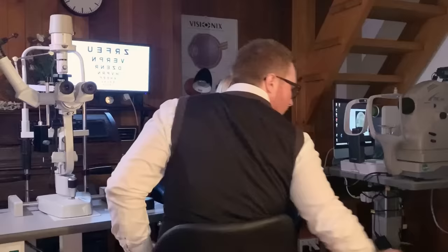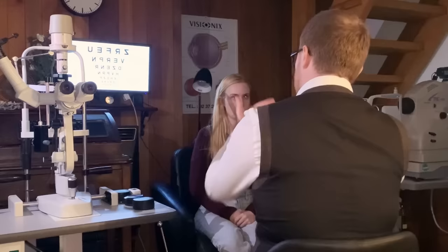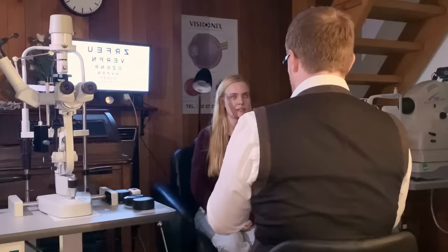Right. So the next thing we're going to do is have a look at your eyes on the microscope. So we've obviously taken some nice images of the back of your eyes, but the microscope will give me a good close-up view of all of the structures of your eye at the front and the back. So it'll be just a good addition for checking your eye health. And I'll check your blood pressure as well, because obviously we've been looking at your blood vessels, so it's very good to also check your blood pressure as well.